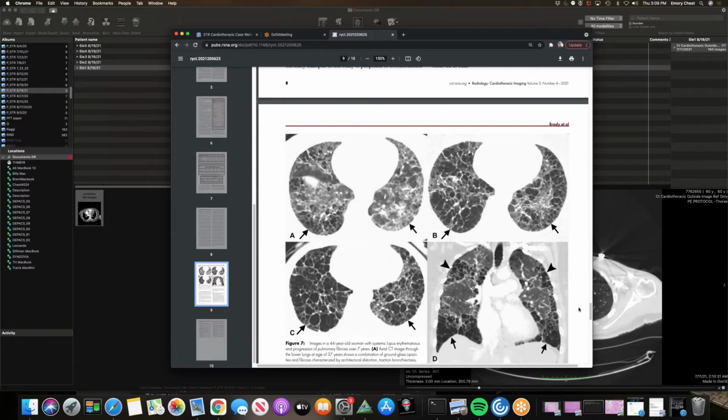Right. You can see quote unquote honeycombing, and it also depends on what a pathologist used to describe honeycombing. Is it a true fibroblastic focus around a cystic space? Other people just say, oh, there are areas of plugs or interstitial plugs that look like organizing pneumonia, but they see them in the interstitium and say, oh, that's a fibroblastic focus. But by definition, pathologically, it has to be adjacent to a honeycombing space.